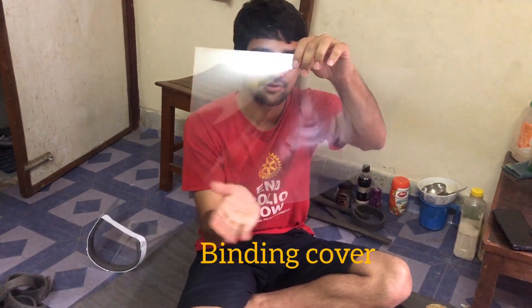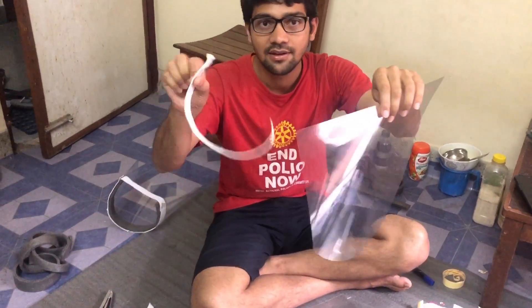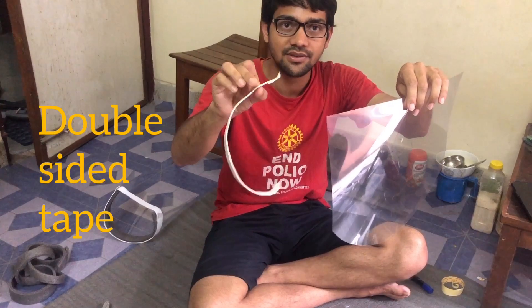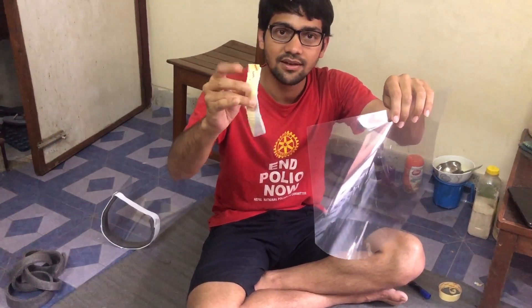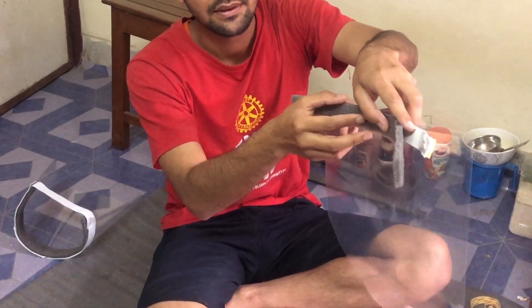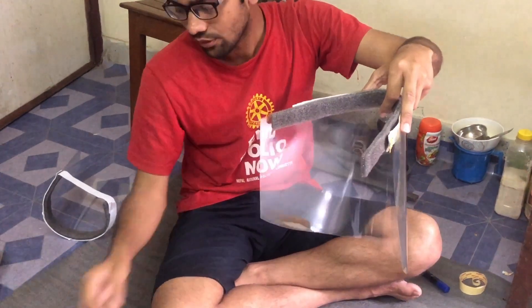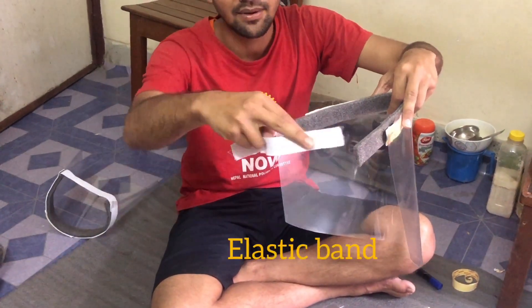This is a binding cover. I will show you the slant. It is a 22 by 29 cm binding cover. This is a double-sided foam tape. Here is the corner foam tape and a corner foam peak.